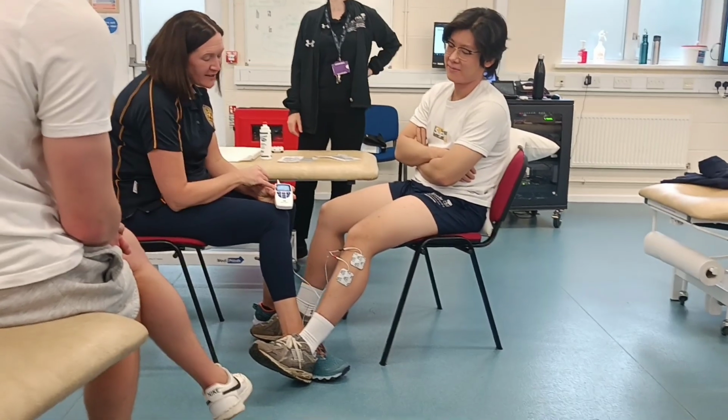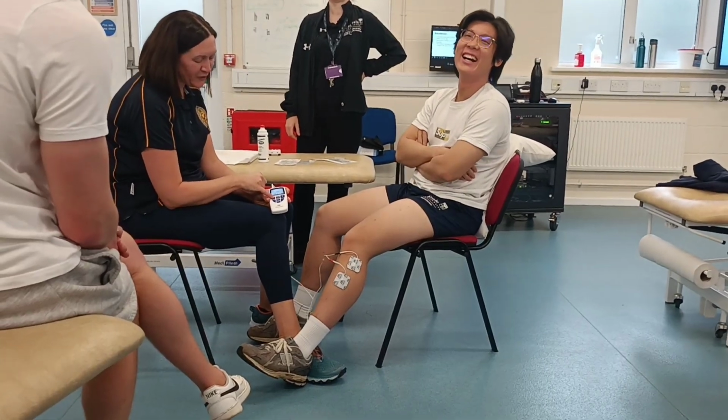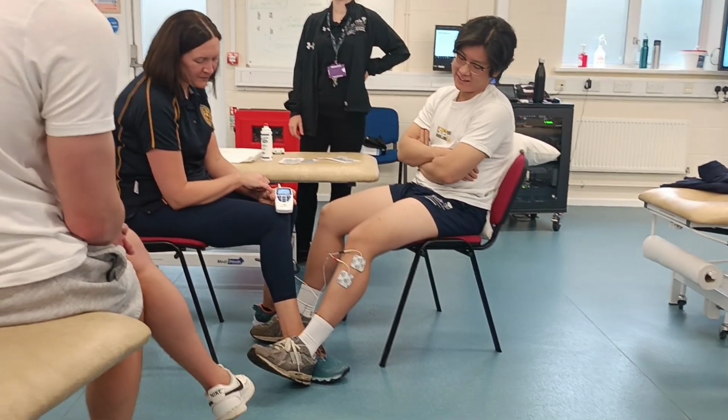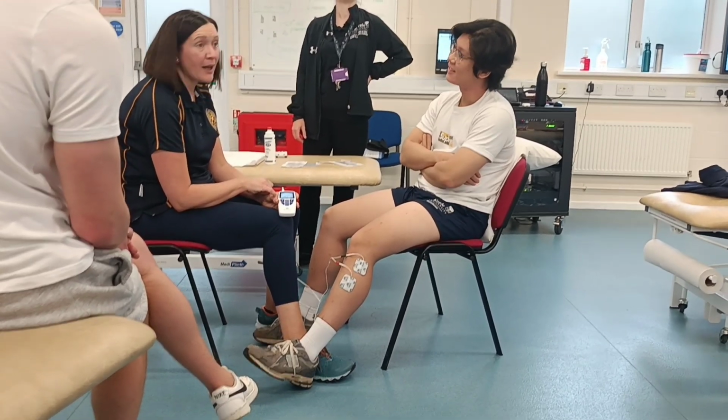So just to give you an idea, it's not a competition, you will all have different intensities, but that's on 40, 44, 45. Okay, let's just give you an idea of the sort of intensity that it's on. Okay, so shall we have a look? Yeah, any questions about that?